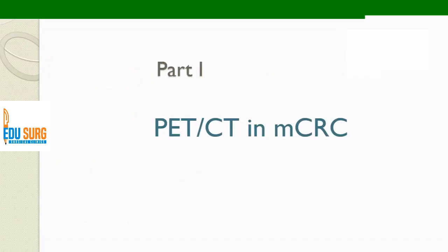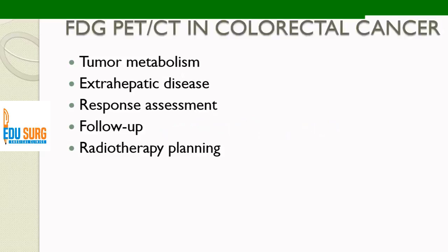There is a role of nuclear medicine in management of metastatic colorectal carcinoma. I shall begin the first part of my talk today. What is the role of PET-CT in colorectal cancer? We shall see whether it can characterize the tumor metabolism with the SUV max, where we shall be using FDG to study the glucose metabolism of the tumor cells.